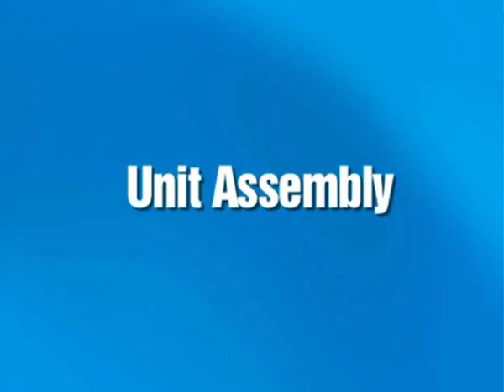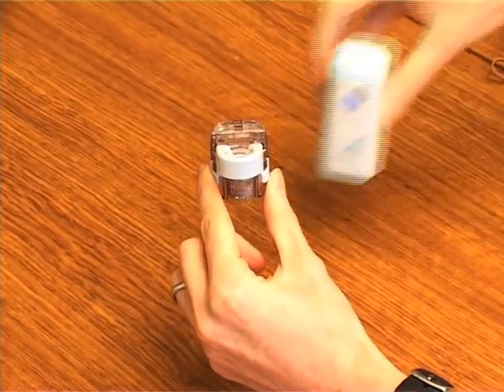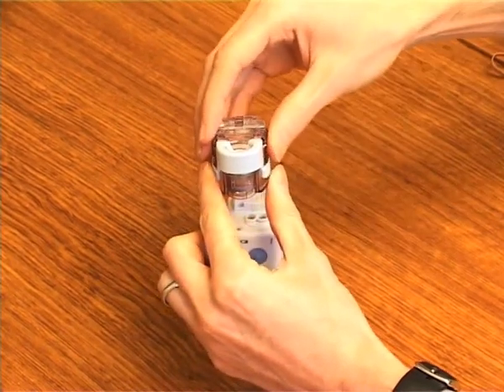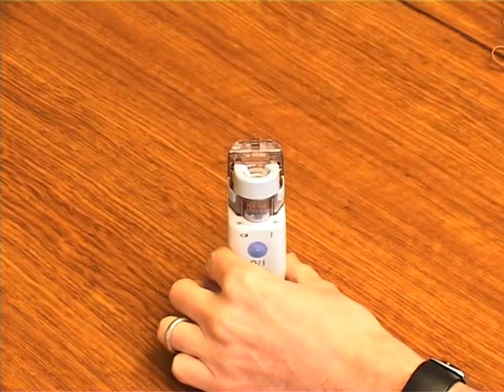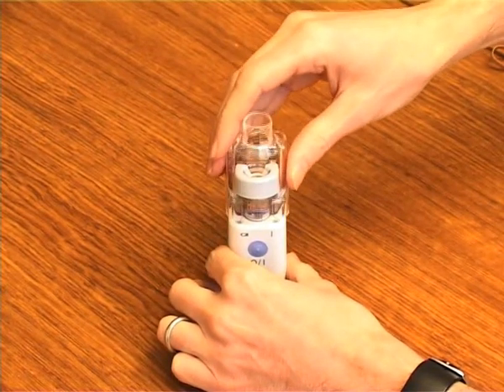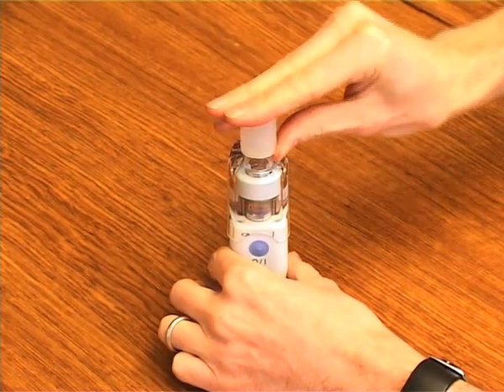Unit Assembly. To start, install the mesh cap on the medication bottle, then place the medication bottle in the main unit. Attach the mask adapter to the main unit and lastly, install either of the masks to the mask adapter.